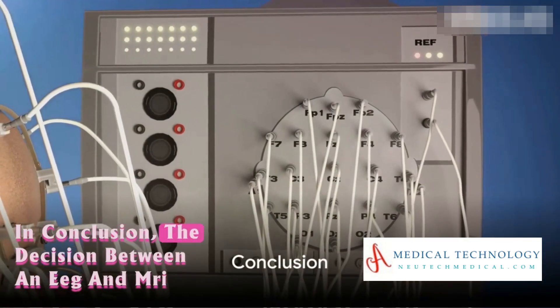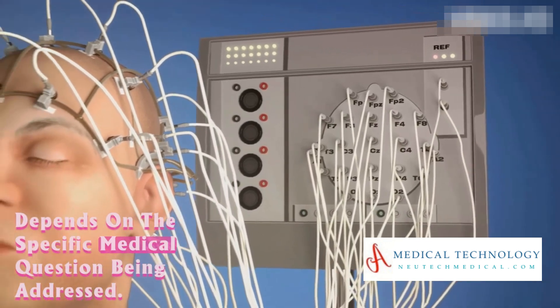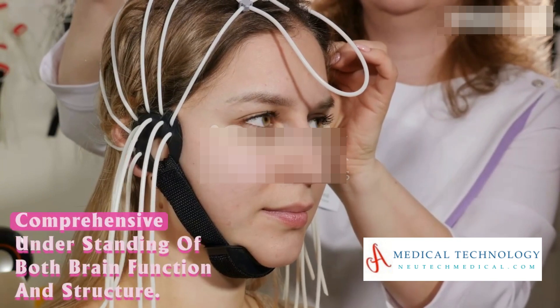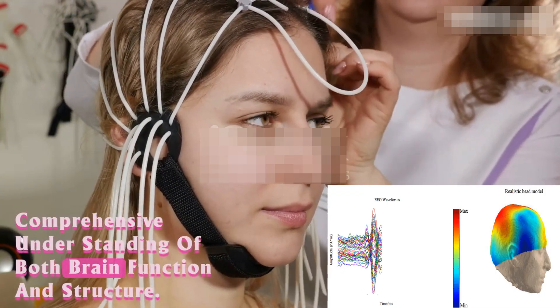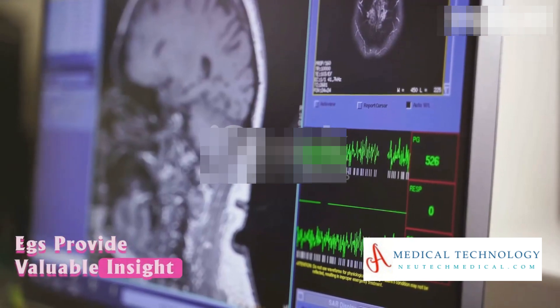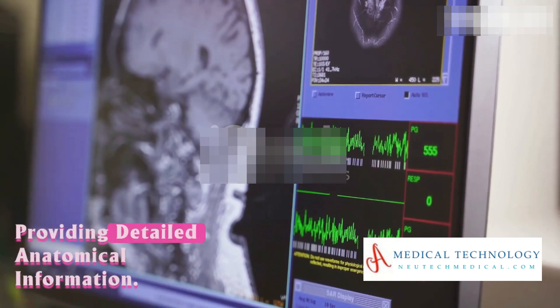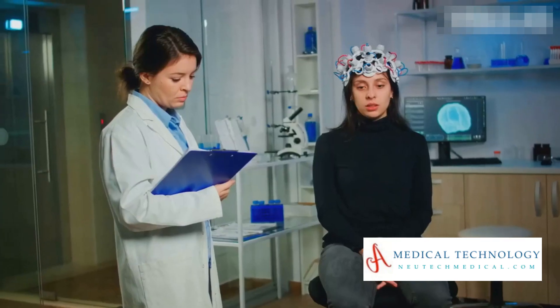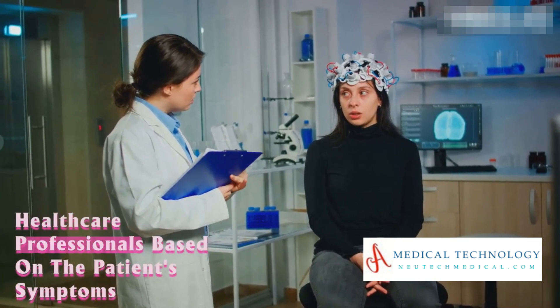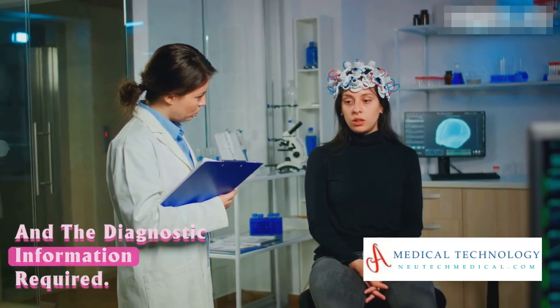In conclusion, the decision between an EEG and MRI depends on the specific medical question being addressed. Often, they are used in tandem to provide a comprehensive understanding of both brain function and structure. EEGs provide valuable insight into dynamic brain activity, while MRIs excel in providing detailed anatomical information. Ultimately, the decision is typically made by healthcare professionals based on the patient's symptoms and the diagnostic information required.